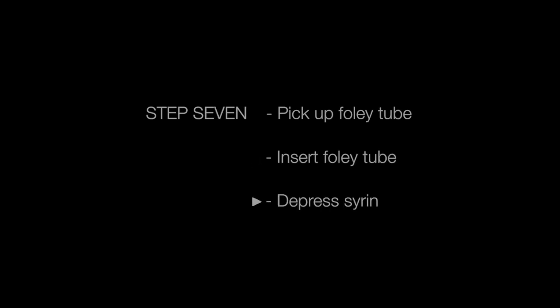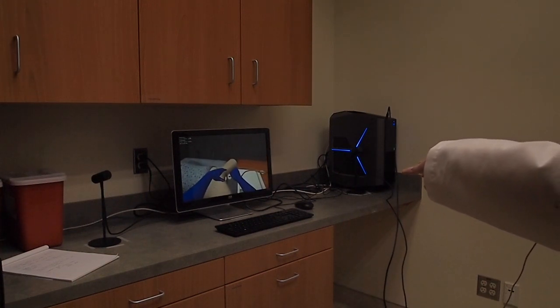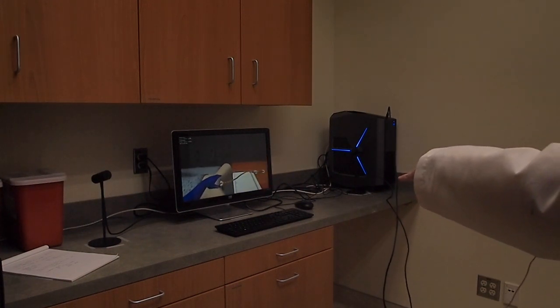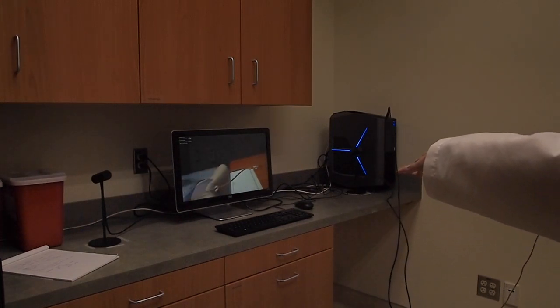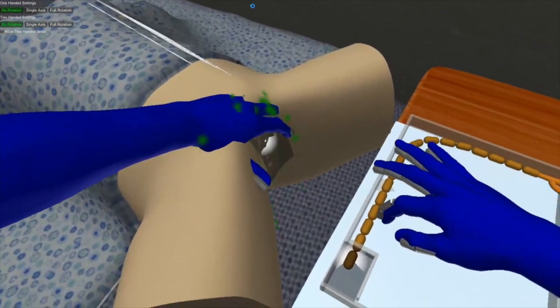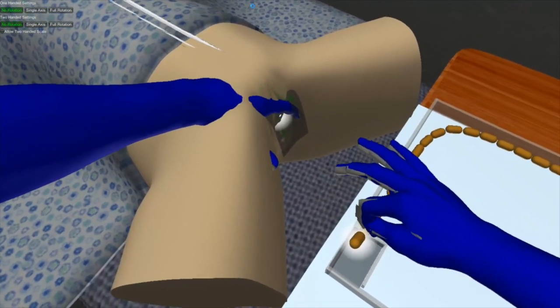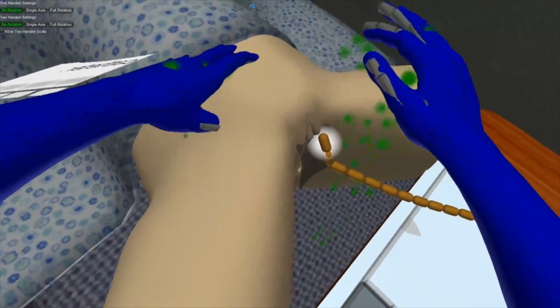Now we will insert the Foley tube, maintaining a sanitary field as always. With your left hand still on the patient, pick up the Foley tube with your right, insert it, and depress the syringe plunger. Again, pick up the Foley tube with a pinching motion, insert it, and depress the plunger.